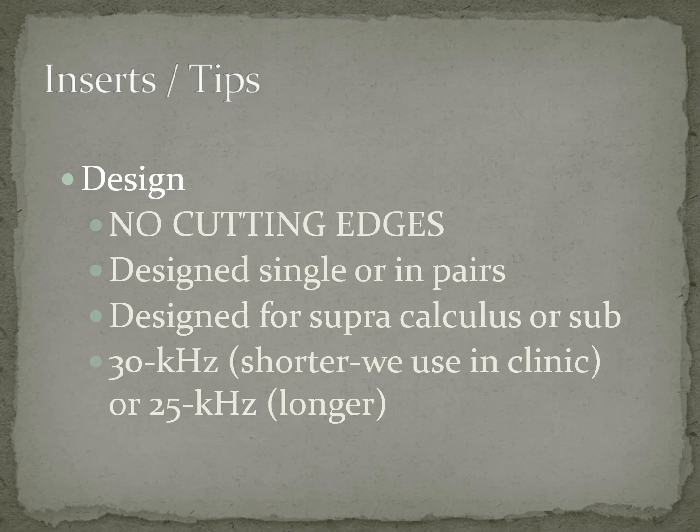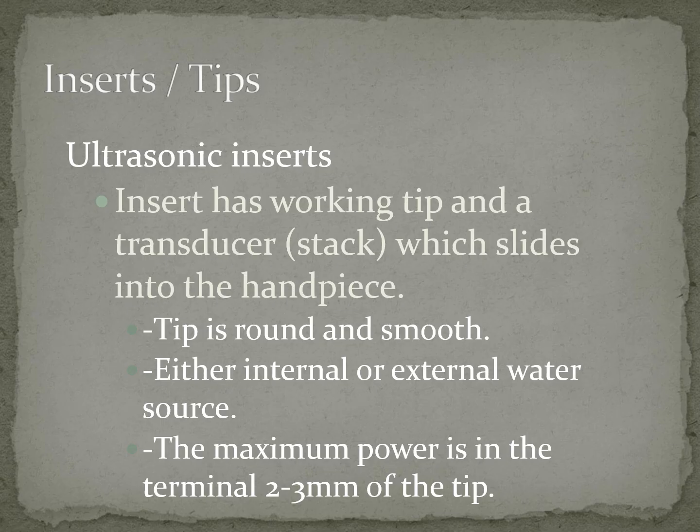Now there's many different designs, but none of them have any cutting surfaces. Okay, so cutting surfaces are just for your hand instruments. These only work by their mechanical vibrations. Okay, so they're designed to be worked, like I said, in singles or in pairs. So it could be like your Gracies, you know, and you could have one for the mesial, one for the distal. Okay. So the insert has a working tip and a transducer, that magnet stack, which slides down into a handpiece.